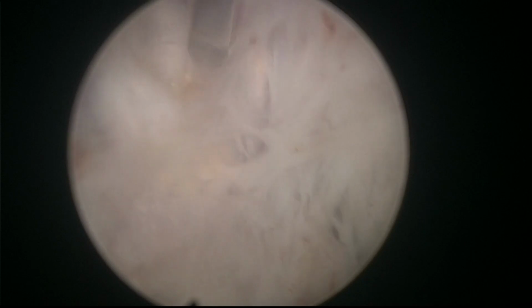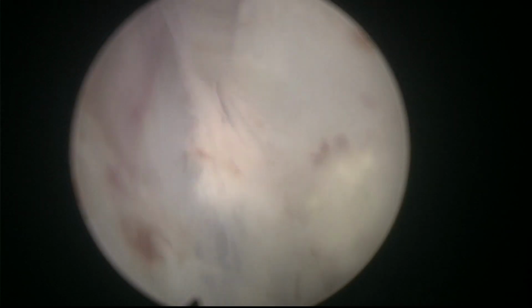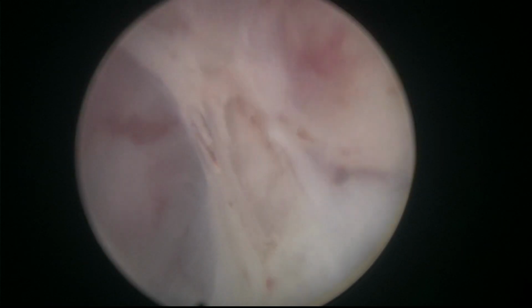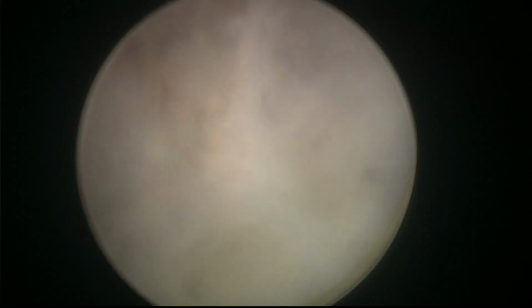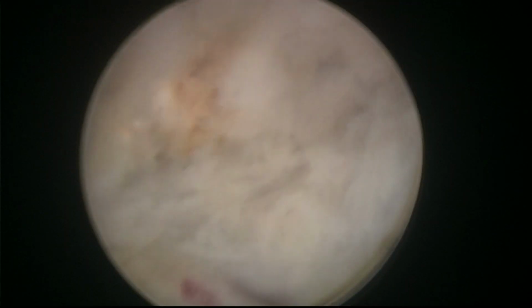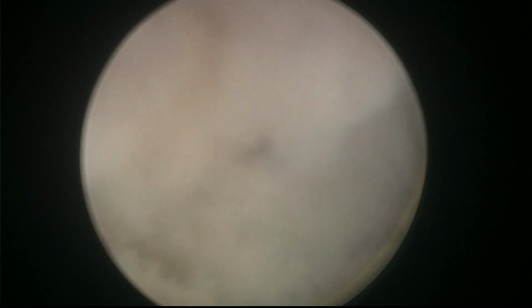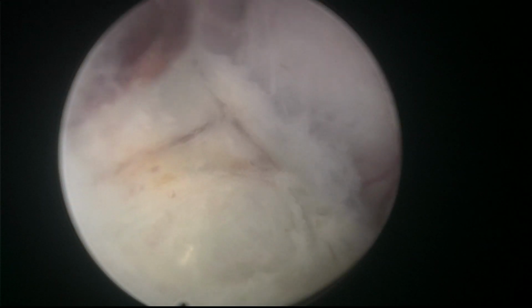Let's move on a little bit with the lateral plane. Here we saw a bleeder, so come back to check. You see the quality of hemostasis is amazing. The laser opens the plane where it has to be opened, following the anatomical plane between adenoma and prostate. And it's looking better. Let's see if we can come up there and release this anterior mass.